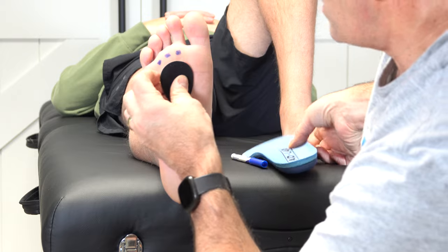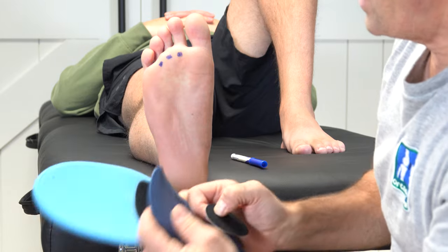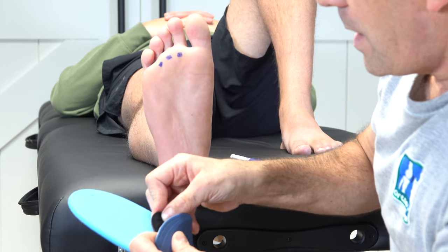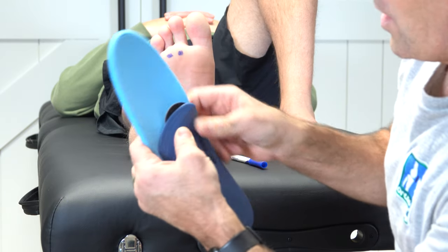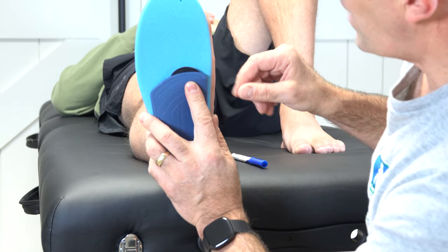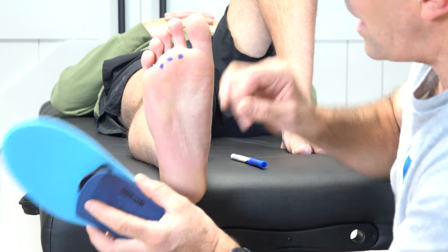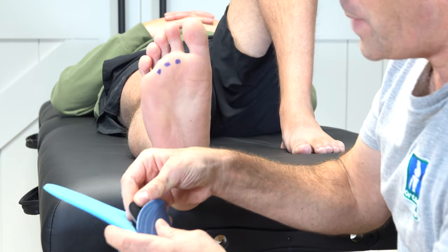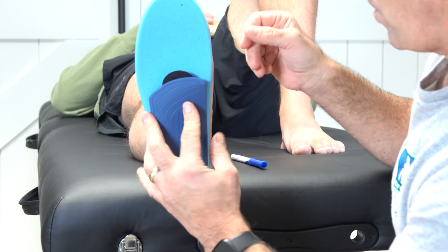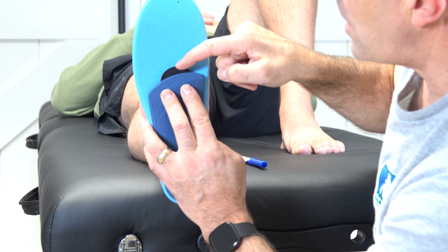The way we're going to do this in this particular insole is we're going to take that metatarsal pad. Let's say he's most tender underneath the second one — we are going to put this pad in here, closer to the second metatarsal, so that it strikes just behind that joint. Usually it's the second and the third, so we most commonly will put this metatarsal pad in the middle between the two. It's Velcroed, and then the metatarsal heads are going to land around it and not necessarily on it.